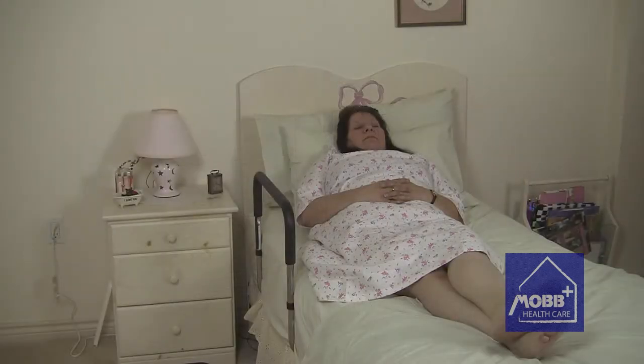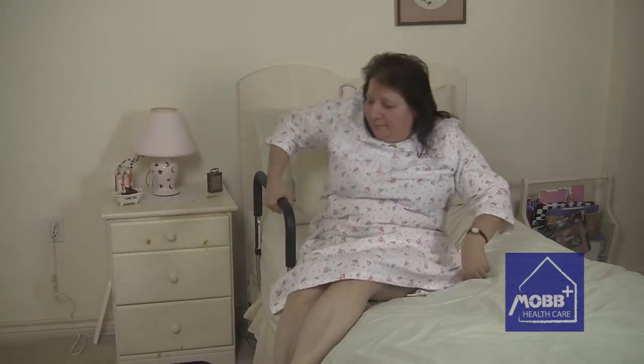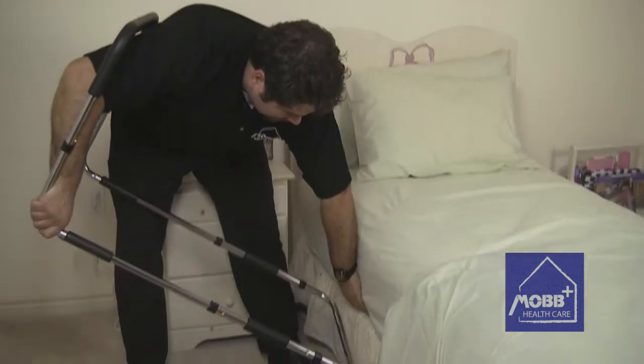The Bed Assist Rail offers improved independence for the user, decreased likelihood of falling out of bed during the night, and reduced risk of twisting while getting in and out of bed.